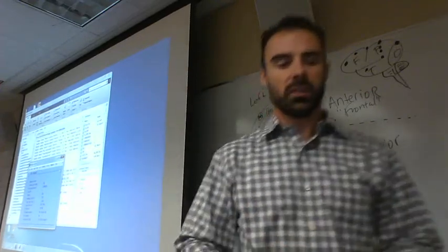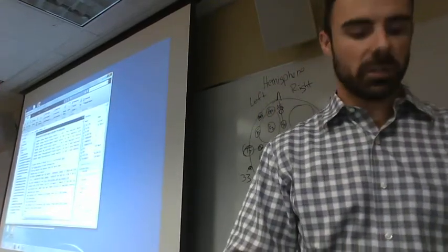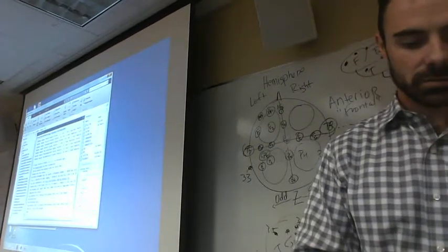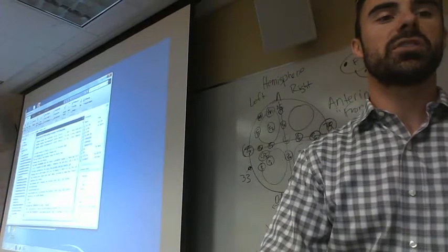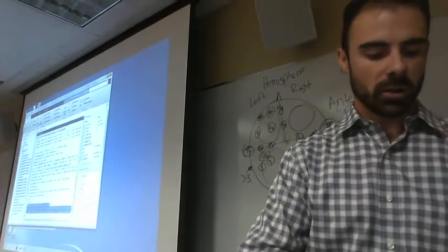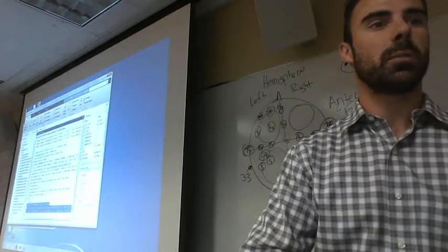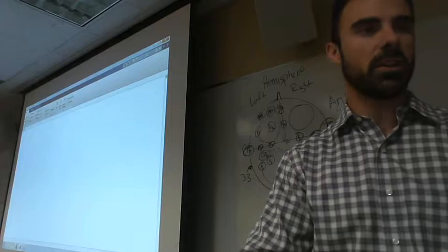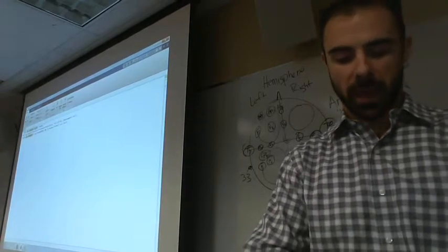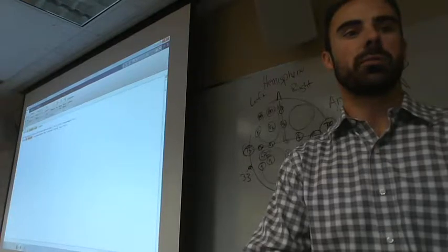It's told to us. Let's first do what we talked about doing before. Let's type EEGH, and let's get an initial output of whatever we did so we can keep track of it. All right, we highlight it, Control-C, copy. We hit New Script on the top left. That opens up our editor with Control-V or paste that information in. I like to press Enter after EEG Lab and separate this a little bit.